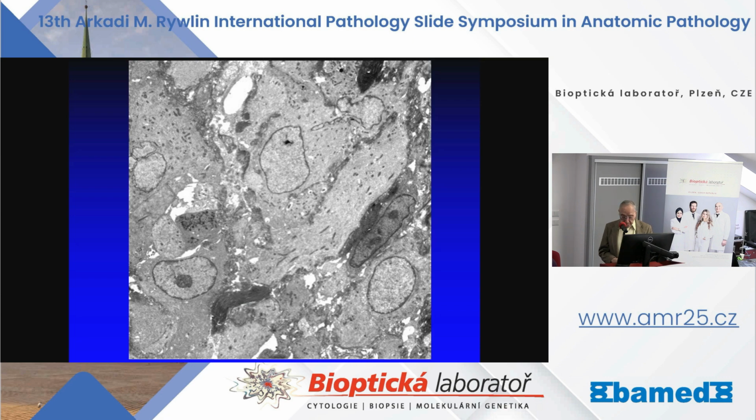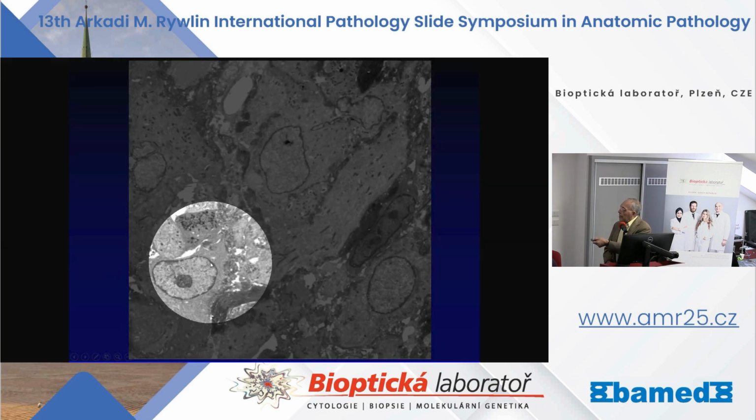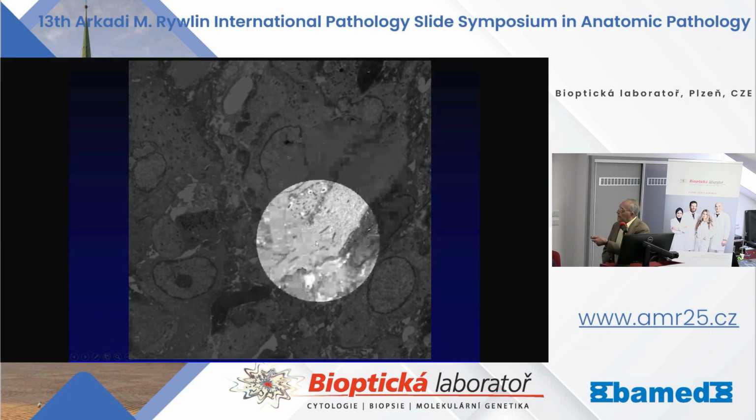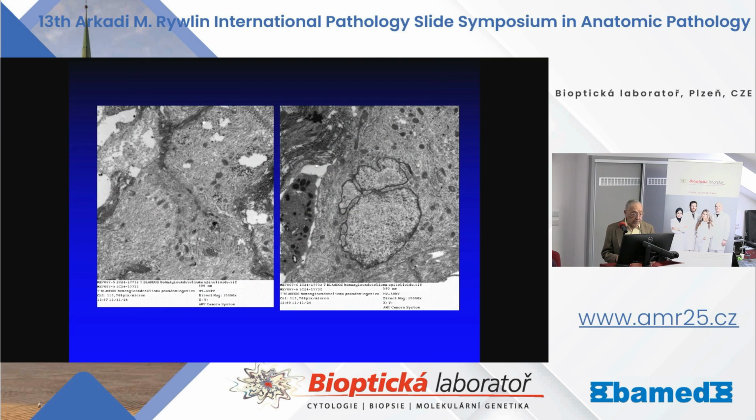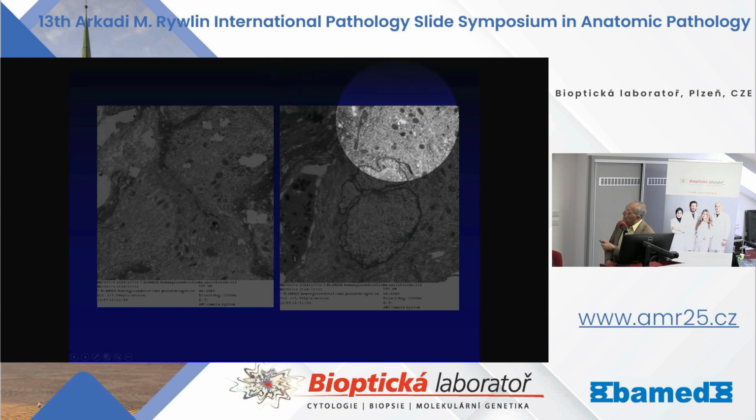This was having prominent nucleoli, ample cytoplasm, and it was filled with intermediate filaments. And in a higher power, you can see many of these Weibel-Palade bodies.